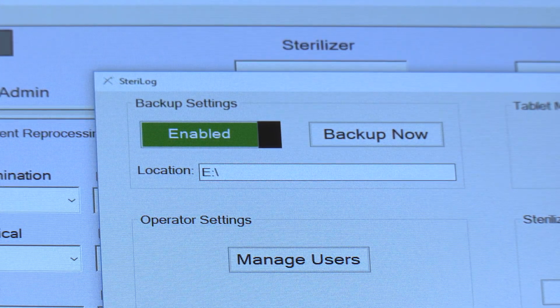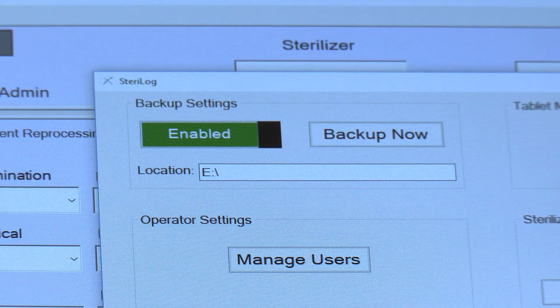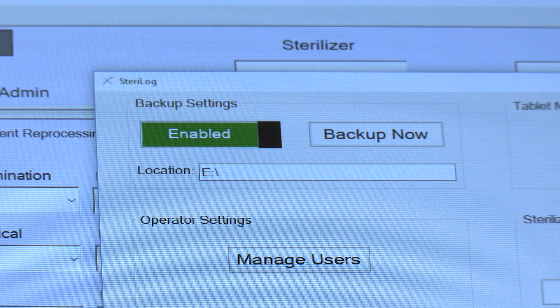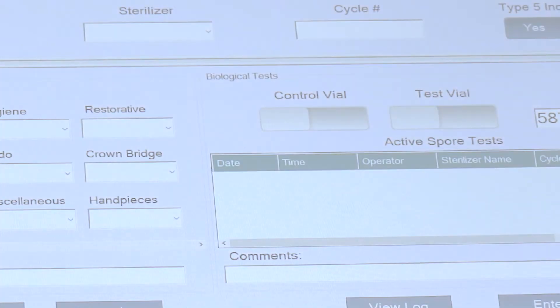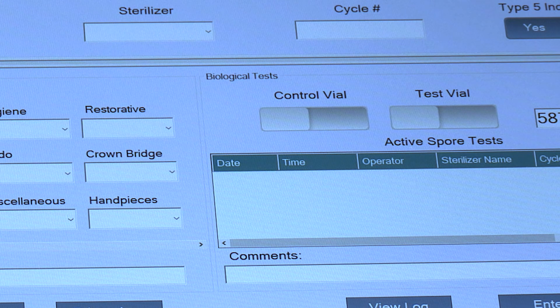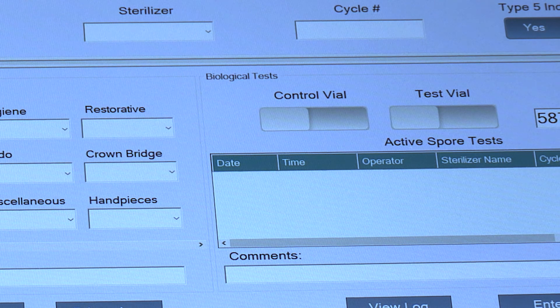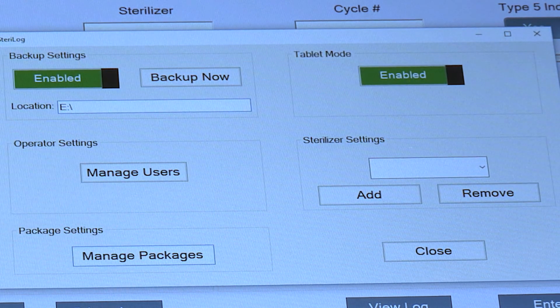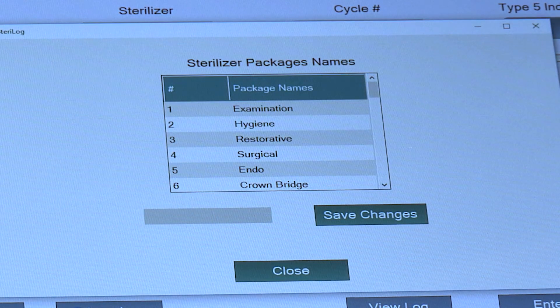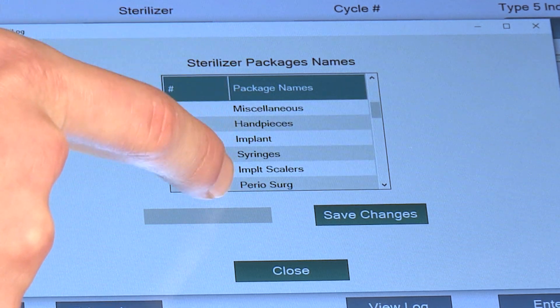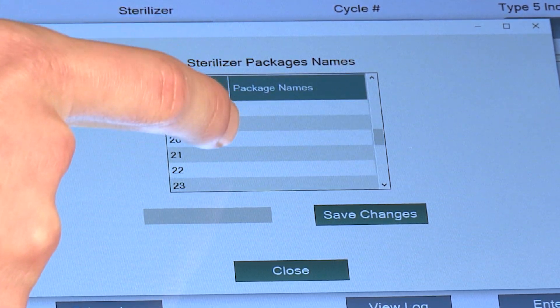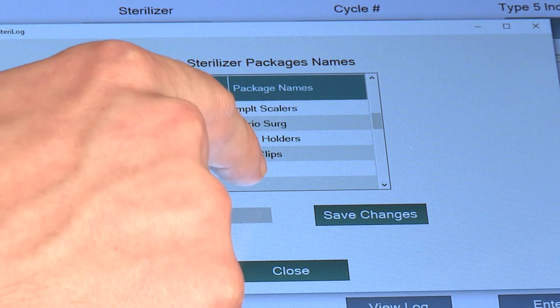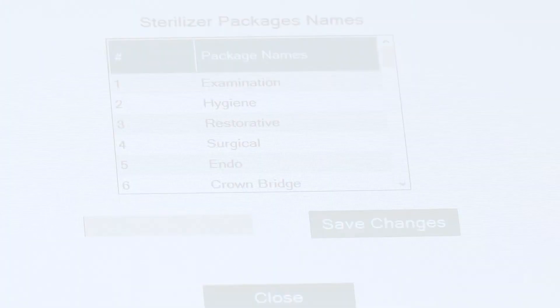Note that backups are automatically done to the backup location on an hourly basis. To customize your instrument kit names, hit Setup then Manage Packages, and you'll notice that there are 36 different options here for fully customizable instrument kit names.